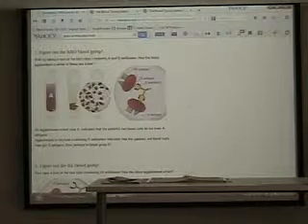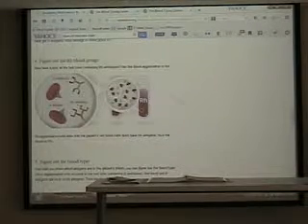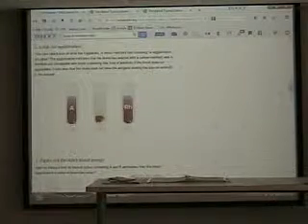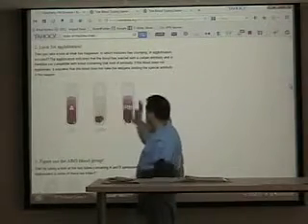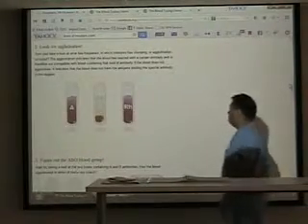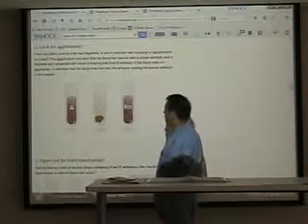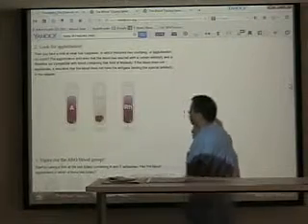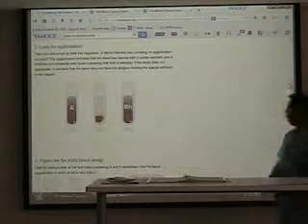And it's the same idea for the RH. The RH, since there was no reaction, therefore it's what? RH negative. So, right here, the blood type of my patient is what? B positive. I'm sorry, my bad. B negative, scratch that. Because there's no reaction here, and there's reaction, and there's reaction there. Okay?